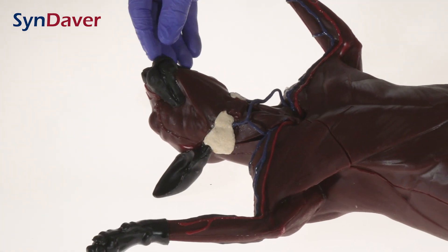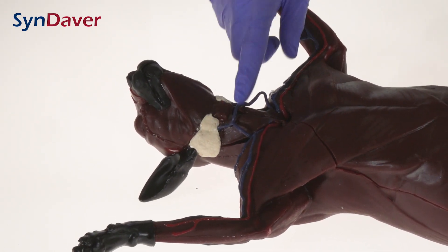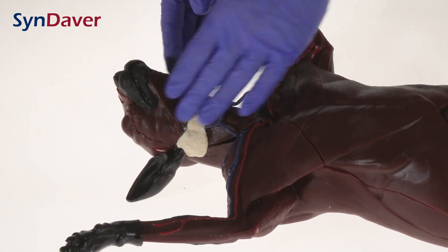Going through the kitty, I'd like to start with the nose and work my way to the tail. We start with the muzzle, the nose, ears. We have the lymphatics, lymph nodes, vasculature, and the facial muscles represented.